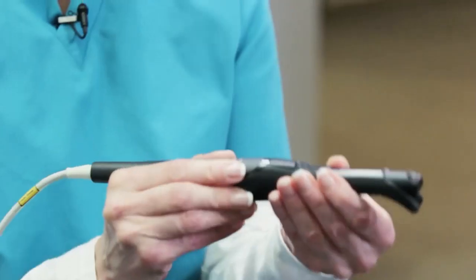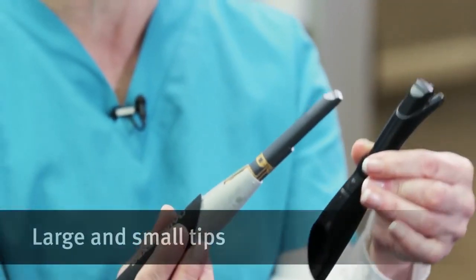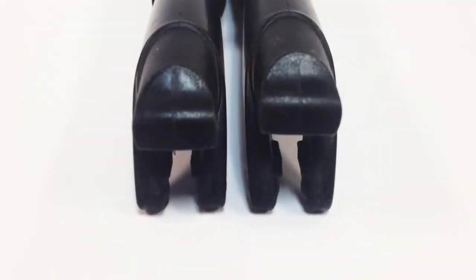It also has two size tips. If you pull this off, this is the actual device, and it has two tips — a large and a small. The difference is the length of the arm.